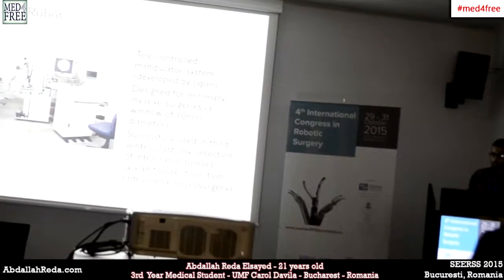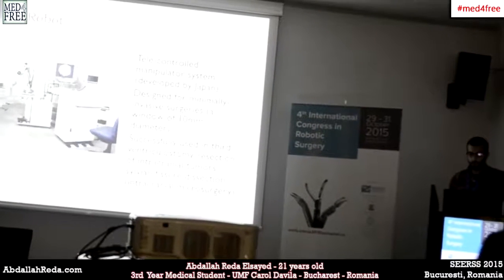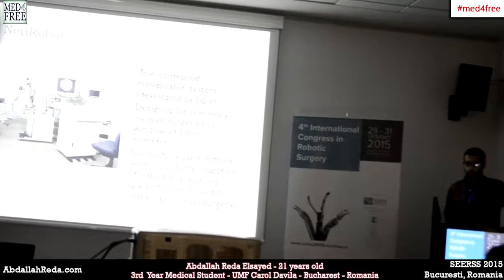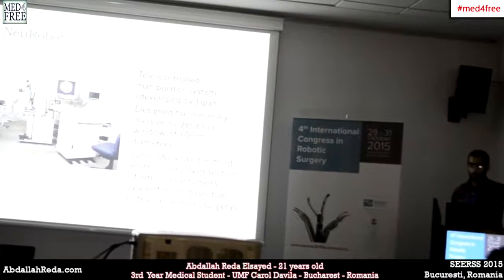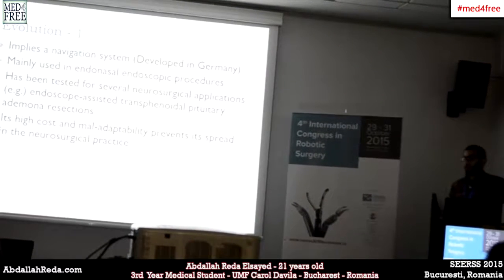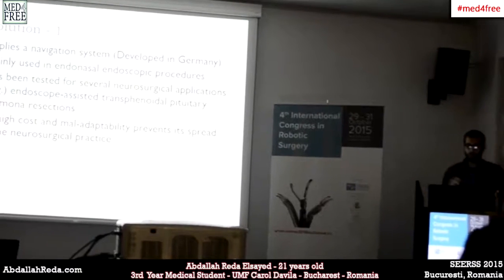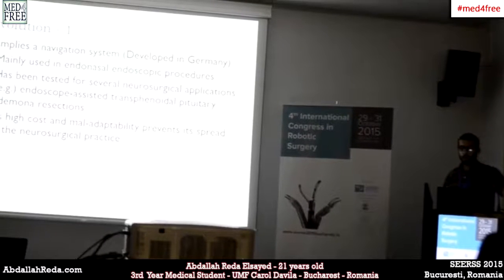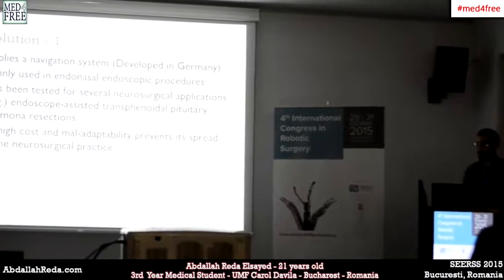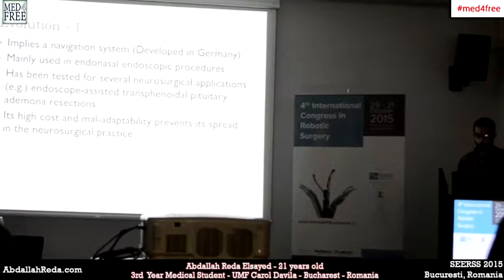Another one is a robot which was developed in Japan, although the name is German. And it also has successful neurosurgical operations, as we can see. One example of incompatible systems is Evolution 1, which had problems with its high cost and its bulkiness also, so it wasn't friendly for the neurosurgeons to work with.